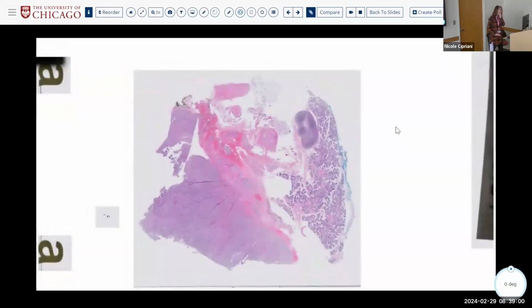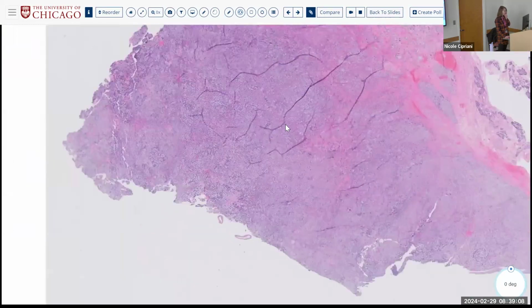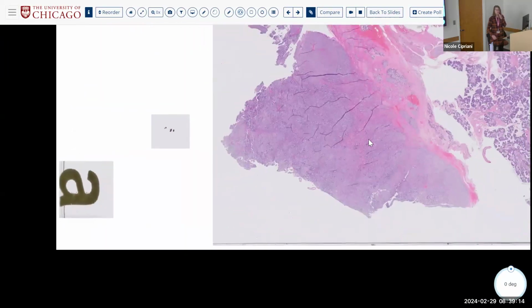All right, so I'll cut to the chase and show you the resection because there are subtle clues on the core biopsy that I think will help us on the diagnosis, but the definitive answer comes in the resection. So did anybody have a preference between pleomorphic adenoma? Why not? Okay. What? Okay, so it's myxoid but not really chondroid, okay. And you said no? Yeah. At least at low power, it looks kind of infiltrated.